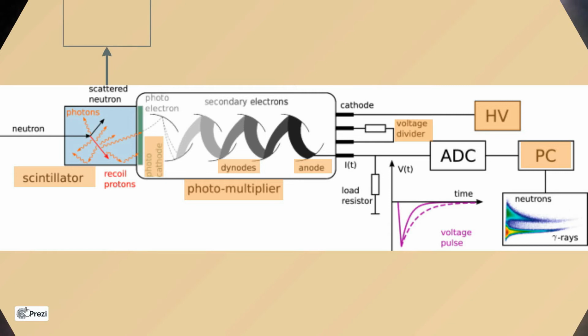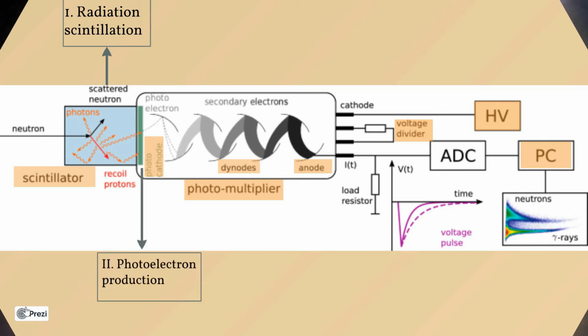So when the radiation passes through the scintillation material, photons are emitted. Then the photons are directed to the photocathode by a light guide in some dosimeters, and some dosimeters don't have the light guide. The photons are converted into electrons through the photoelectric effect and directed to the photomultiplier tube, where the electron multiplication occurs.